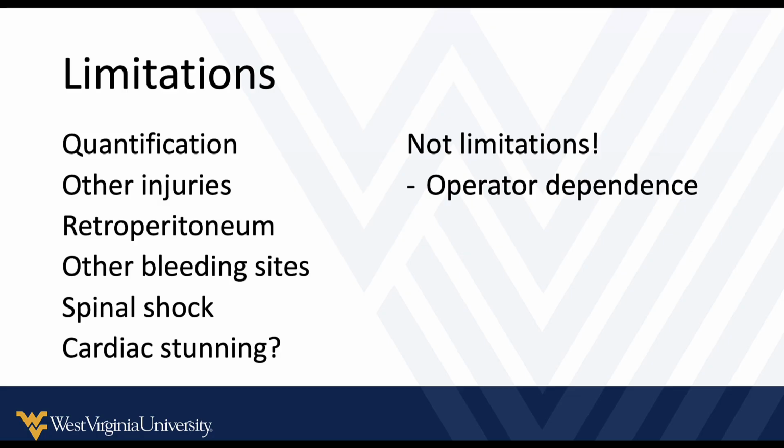Things that are not limitations, and I say this of all of ultrasound, sometimes you'll hear the critique, it's an operator-dependent exam. That's the biggest medicine BS that's out there. Everything you do in medicine is dependent on you being a good operator. Taking a good history is operator-dependent. Performing an intubation, performing a lac repair, everything you do in medicine is operator dependent. It's up to you to be a good operator and be a good clinician.